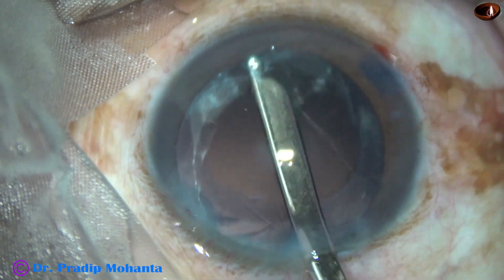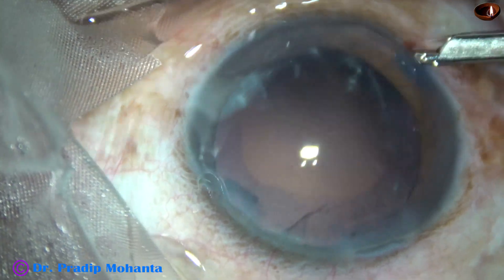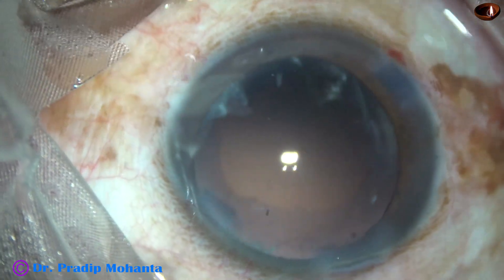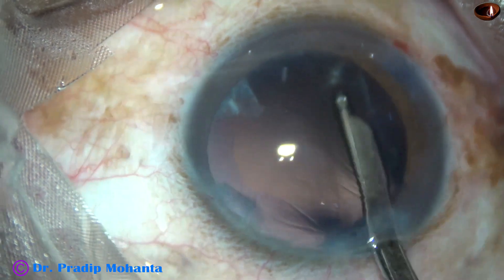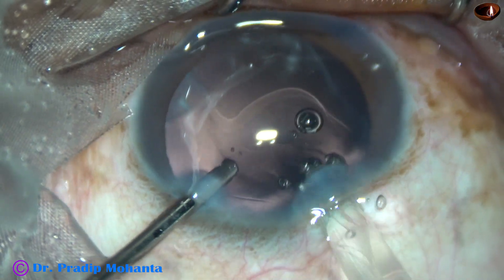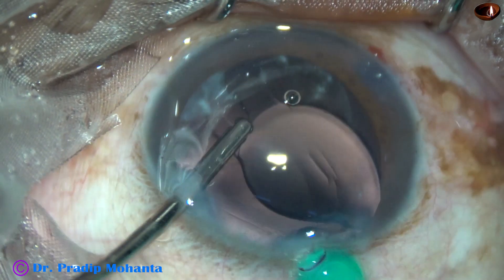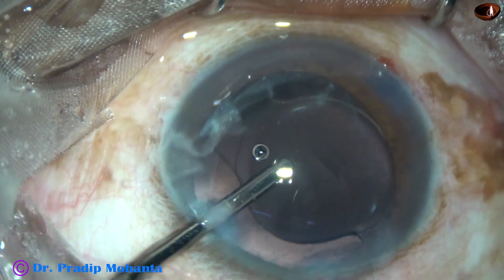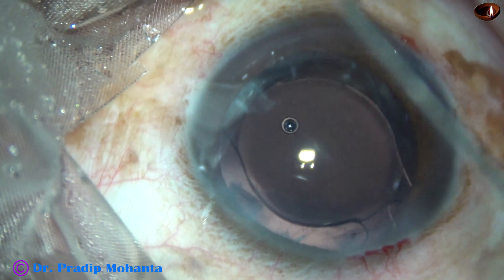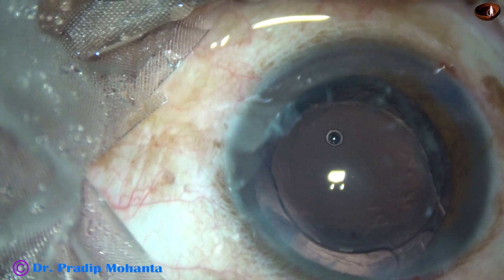Now cortical clean-up is done. I used a Simcoe cannula to remove the cortex — going through the side port to remove the sub-incisional cortex. What has happened in this case is that during hydrodissection, the nucleus is upside down. To flip the nucleus, I used viscoelastic — 2% hydroxypropyl methyl cellulose — then I used two Sinski hooks.